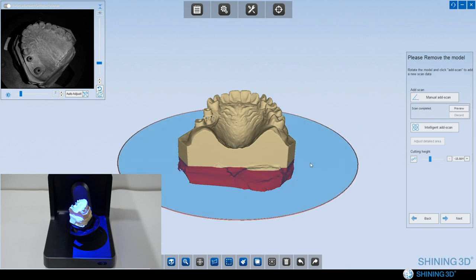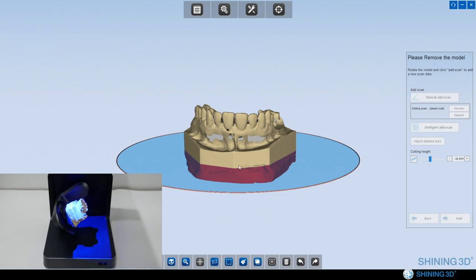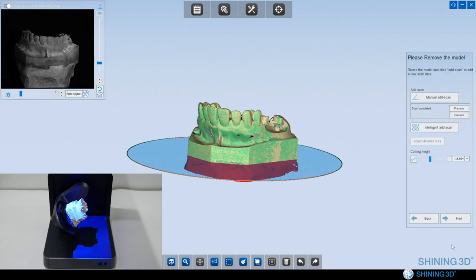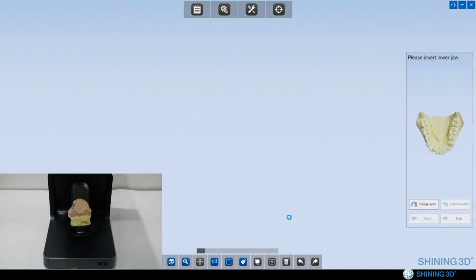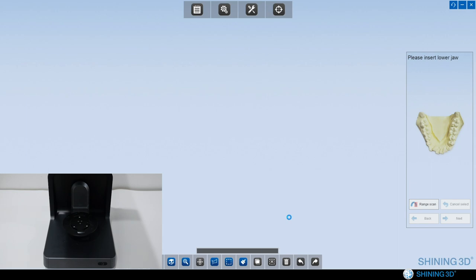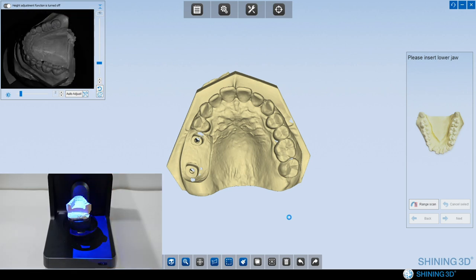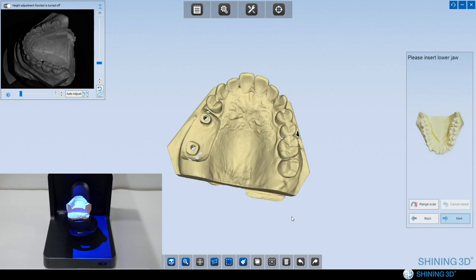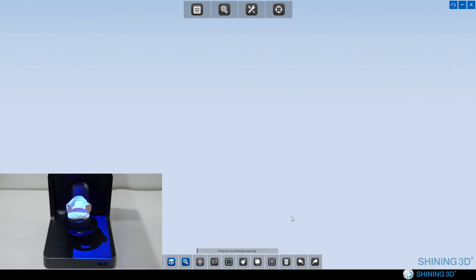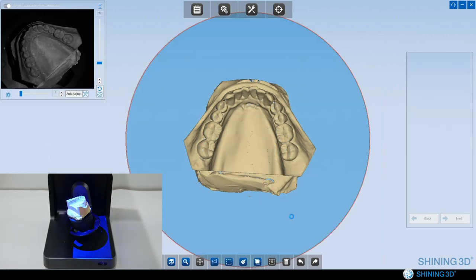So here you can check the model. If you want, you can add scan for some unclear area. Okay, no more work. Next. Finish, no more work.